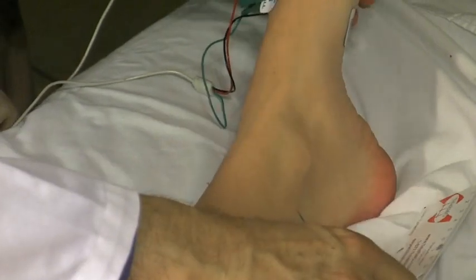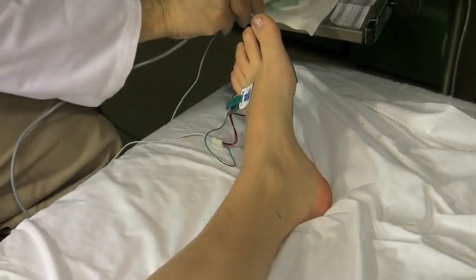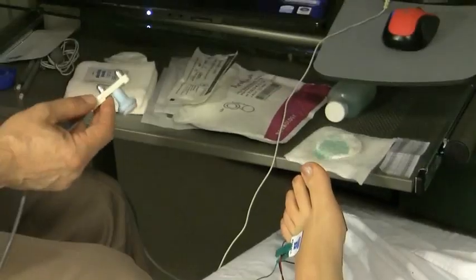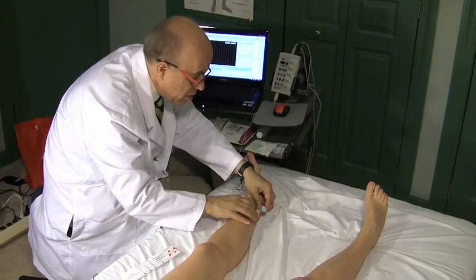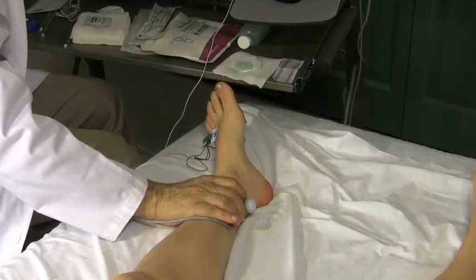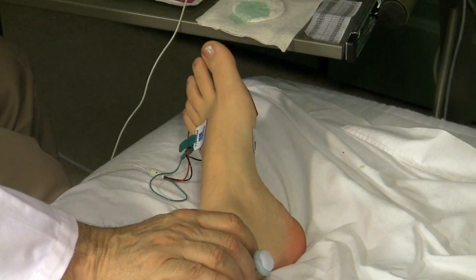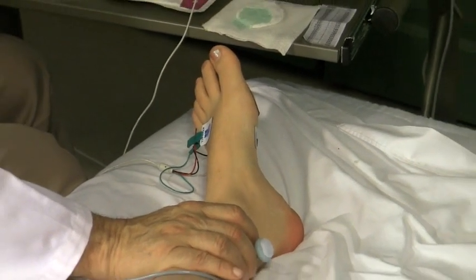Relax your foot. And now we are positioned over the tibial motor left. I'm going to stimulate here — I'm going to try to get my hand out of the way, like so. I'm going to increase the stimulation a little bit. You're going to feel this. We're going to start seeing a response.